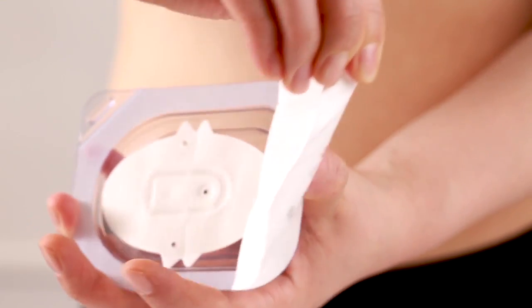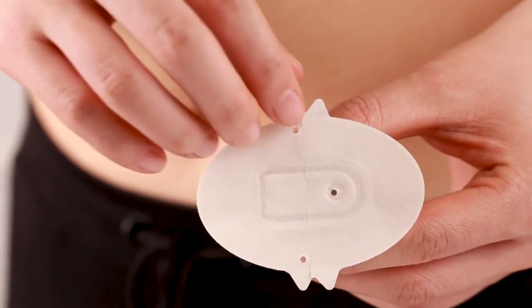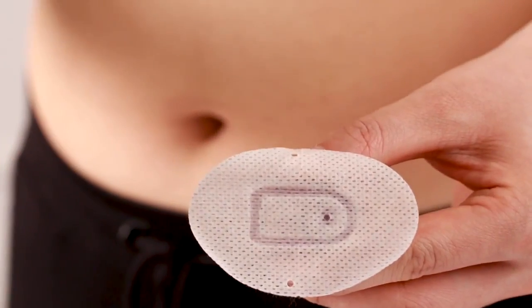Open the sensor package and gently take out the sensor. Remove the two pieces of protective liners and avoid touching the adhesive area.